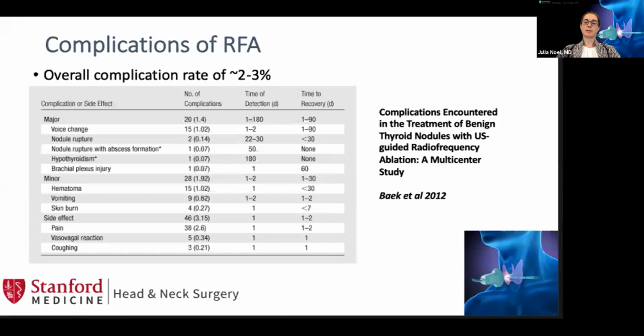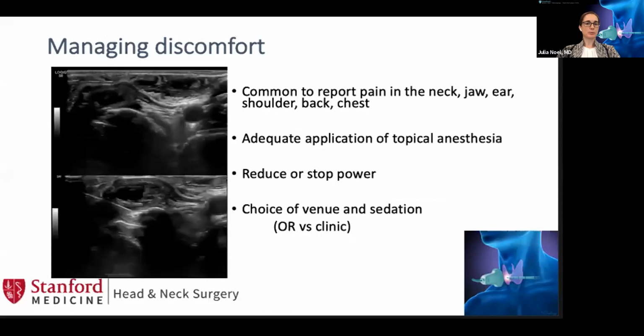And finally, I should mention you can choose to perform RFA in the OR as opposed to in the office, which allows you to use general anesthesia, but you should be aware that your ability to assess for and try to intervene on complications, particularly nerve damage, will be limited.